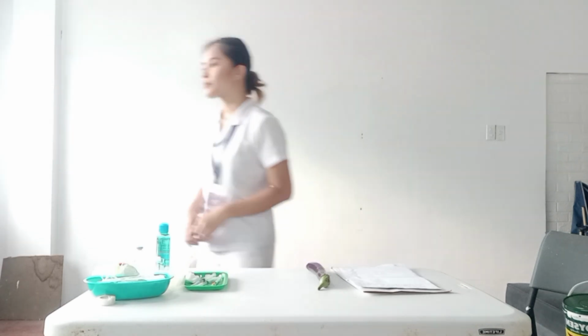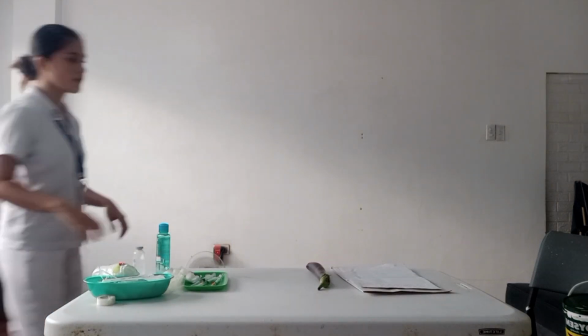Now I have to provide privacy for the client to provide a secure environment and to maintain her dignity. So now I am going to use the forearm as the injection site. Avoid using sites that are tender, inflamed or swollen, and those that have lesions. I will now apply clean gloves as indicated by agency policy.